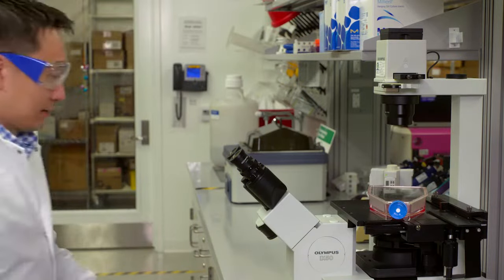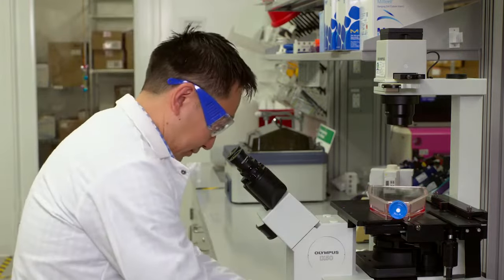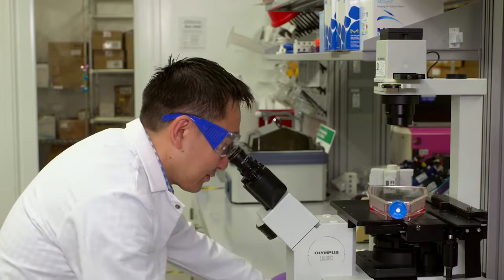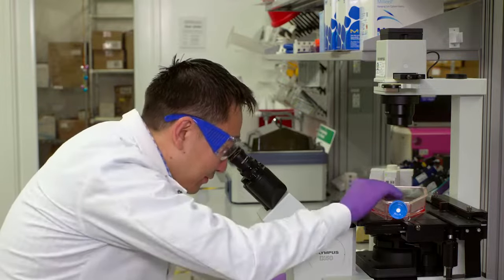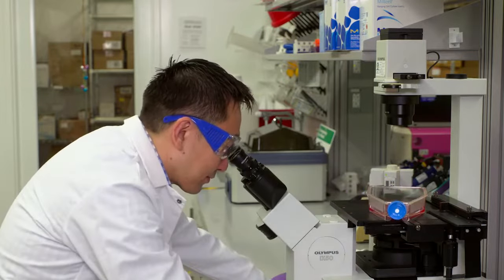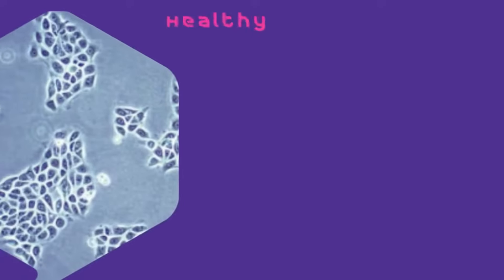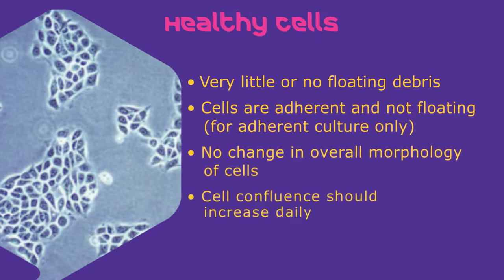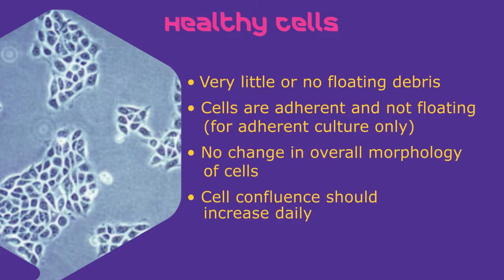Let's start by going over overall monitoring of healthy cells. Please take a closer look. First, by examining cells under the microscope, we can ensure that cells look healthy. You should not be seeing small debris or particles within your field of view, which would indicate cell death and possibly contamination.